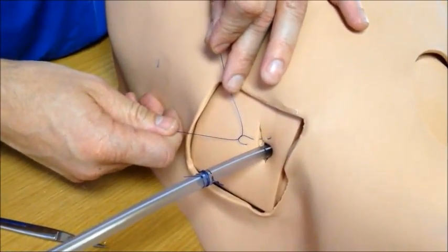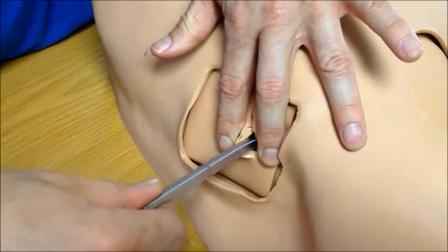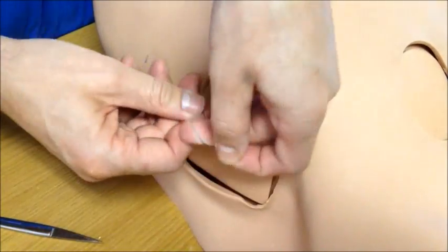Instruct the patient to forcibly exhale against his hand and remove the tube in a single movement from the chest cavity. Pull the sutures tight and complete your suture.